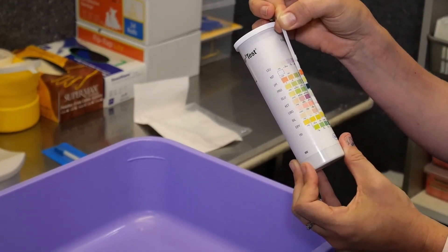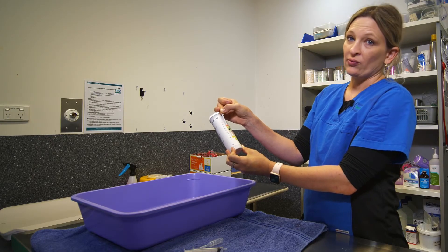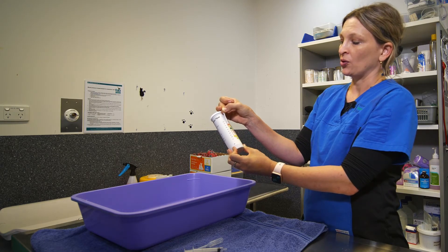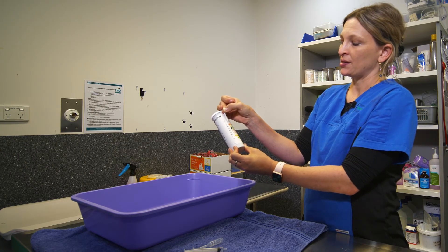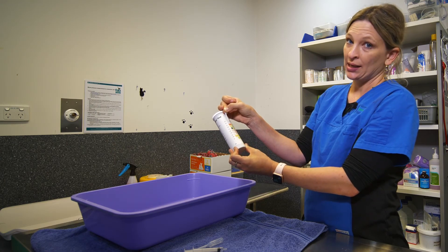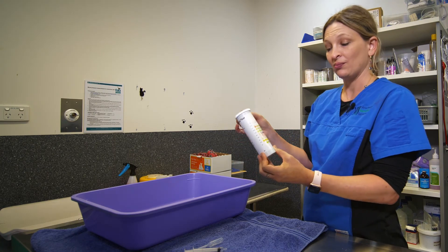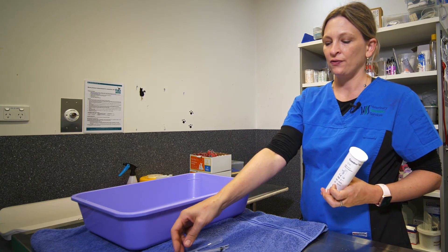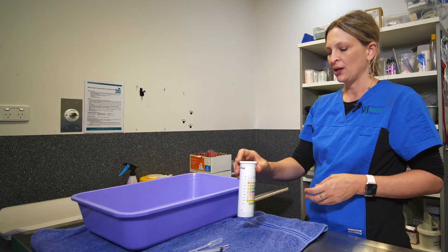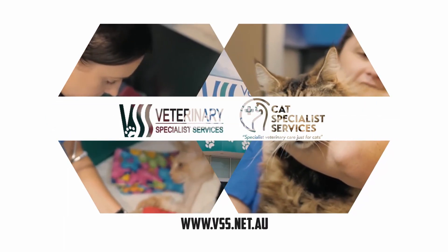Those are really the main results we're looking for in home performed dipstick tests: protein, glucose and ketones. So either call your referring vets or give us a call with that information. Once you've recorded those results you can finish the test — throw this out and contact either your referring vets or us. I hope this was useful and please don't hesitate to contact the clinic at any time if you have any questions.